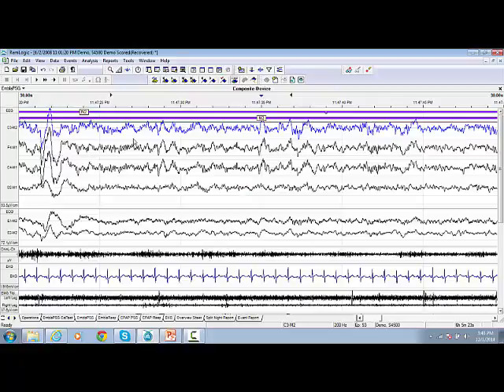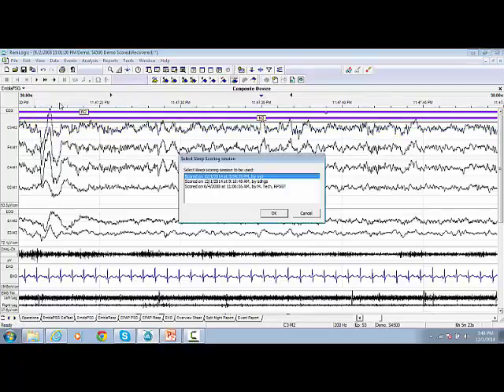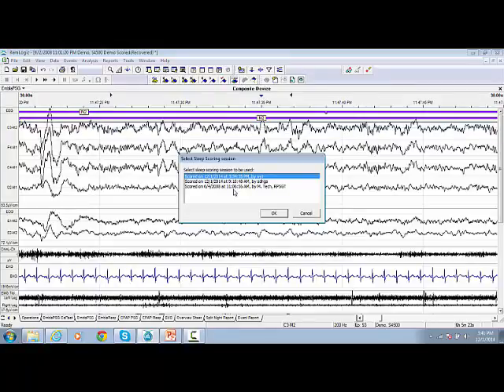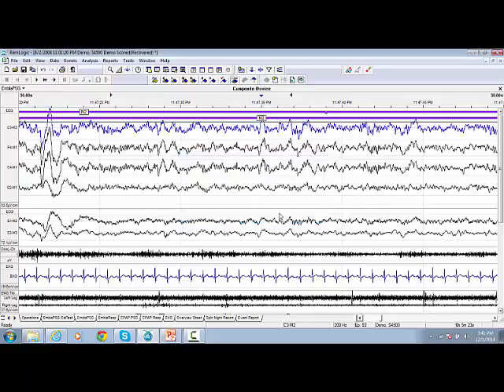To view the hypnogram, go to View and select Hypnogram. Now, you are required to select which sleep scoring session to be used. Then, you click OK.